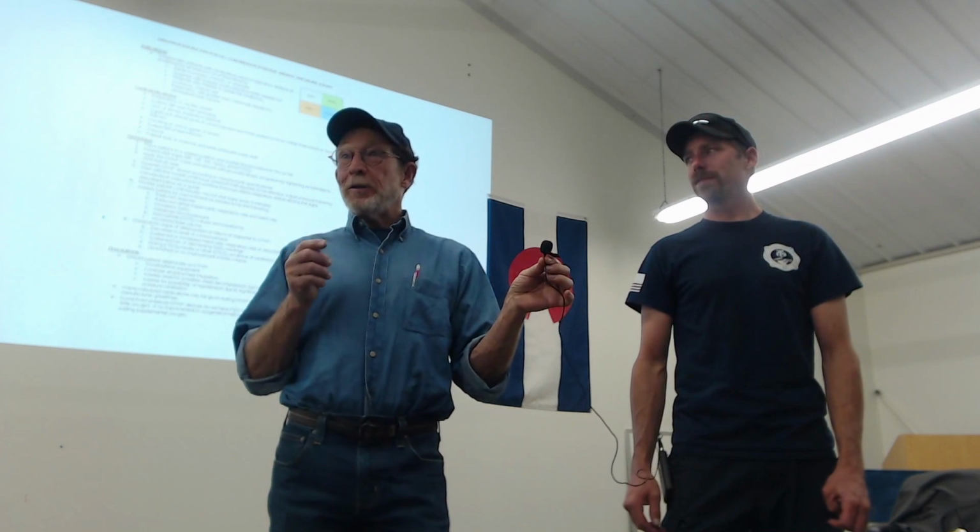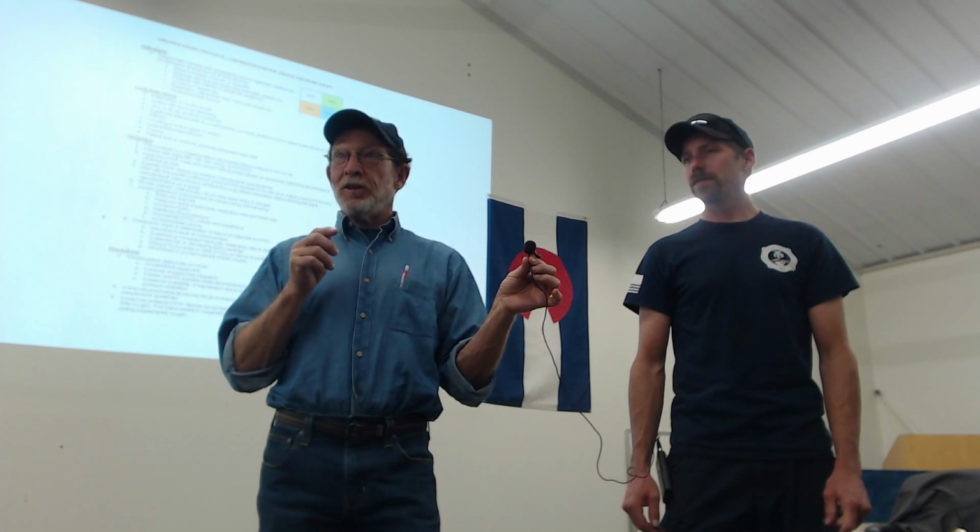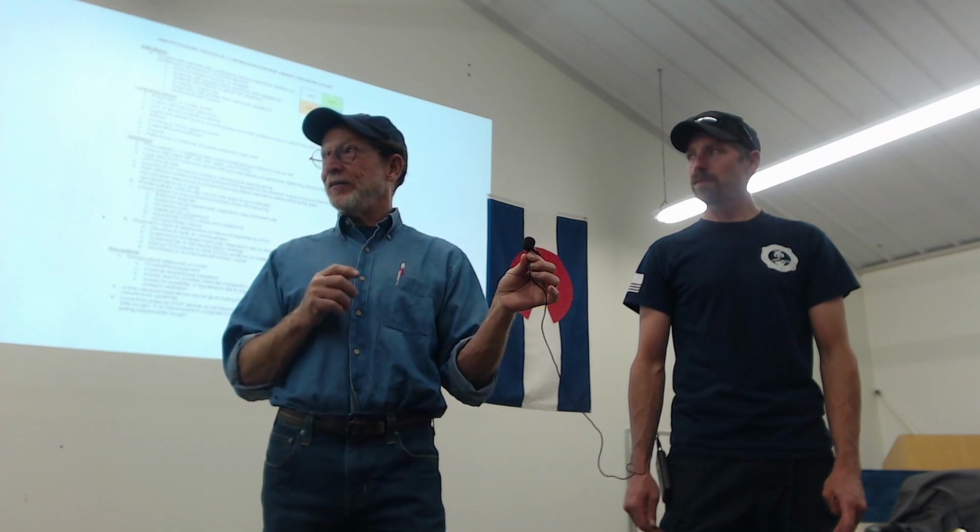Any other questions, folks? Would CPAP be a good idea for a pediatric patient? I don't see anything as far as contraindications in the protocol. You've got some big kids that are 10 to 12, and they have asthma. My take on it is there's no reason that a pediatric patient cannot use CPAP biologically. There is a very strong reason that they cannot use it behaviorally.